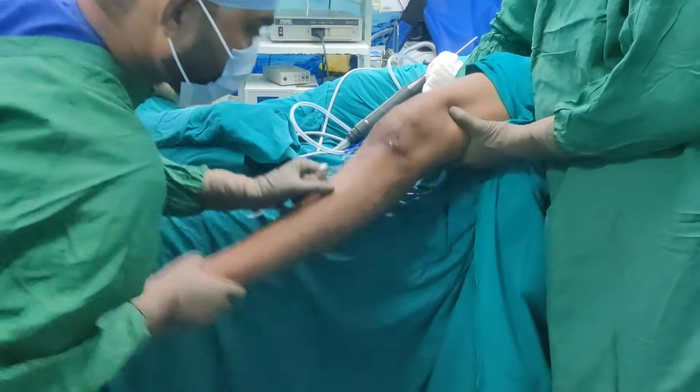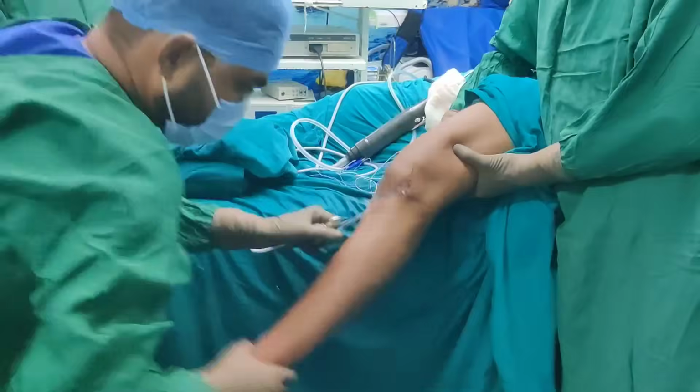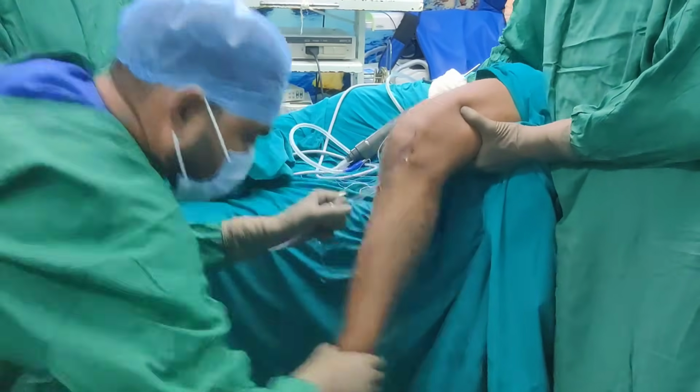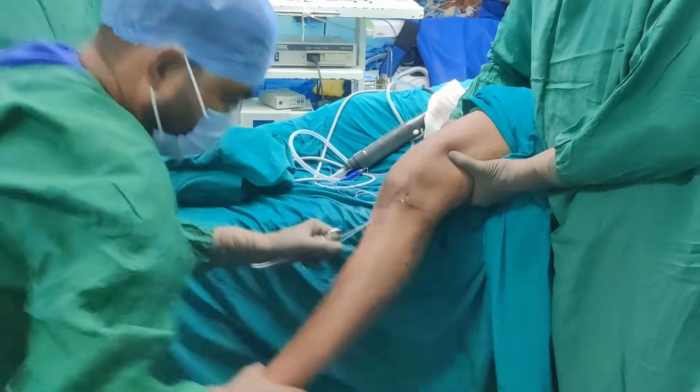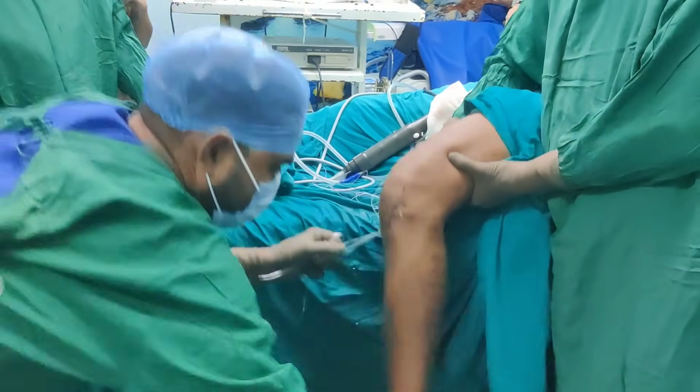So now we are giving it a cycling. We'll do it at least 15-20 times. So you know creep is permanent deformation under constant load, so you need to learn a bit of biomechanics. You don't want your graft to become too loose. So we'll continue like that and then I will join you in a second.